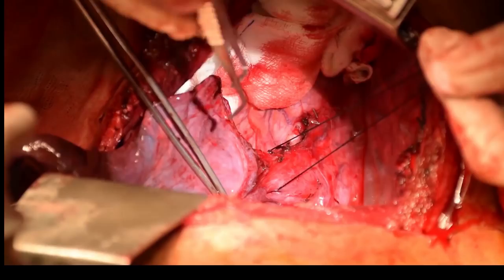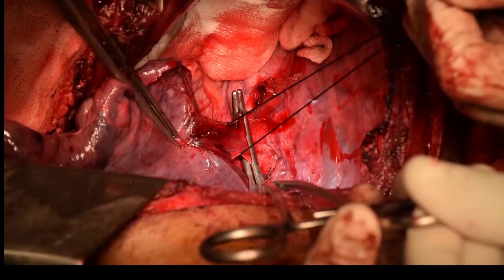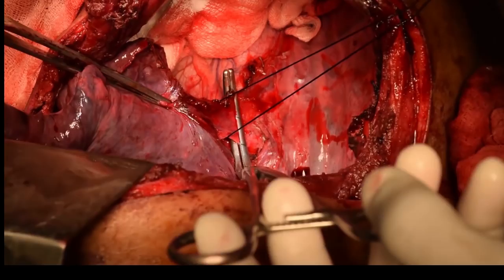The inferior pulmonary vein was then isolated. You can see it is very dilated because a huge amount of blood was going directly into it. The inferior pulmonary vein was clamped, divided, and repaired with 6-0 Prolene continuous suture.